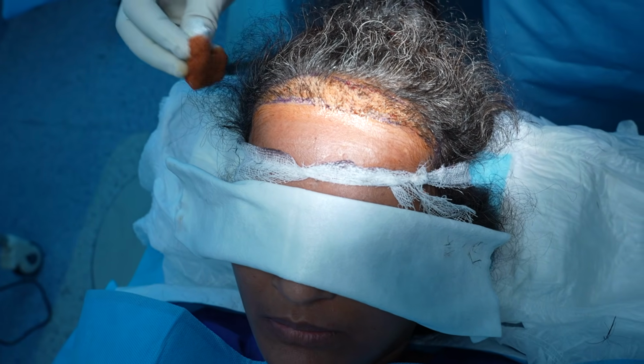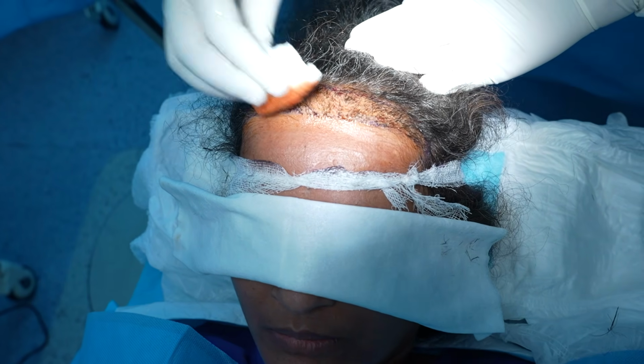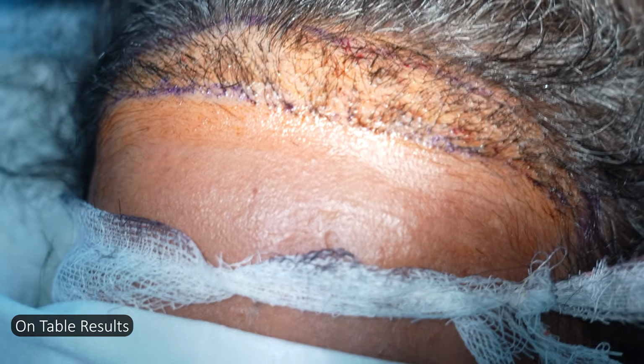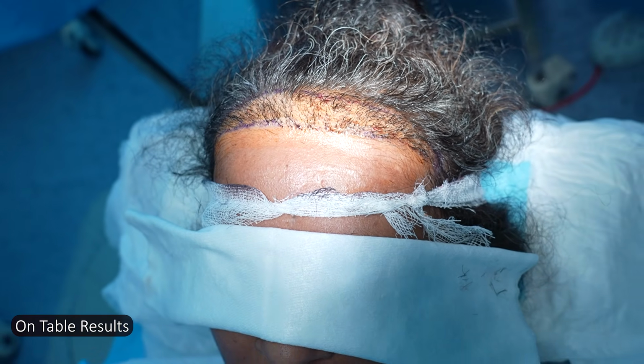So now the follicles have been successfully extracted. We are going to start with the implantation process. In this, as you can see, the area has already been transplanted a year ago.